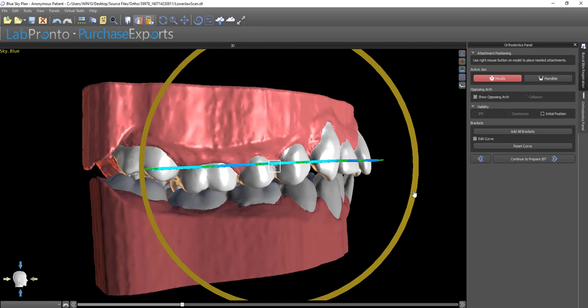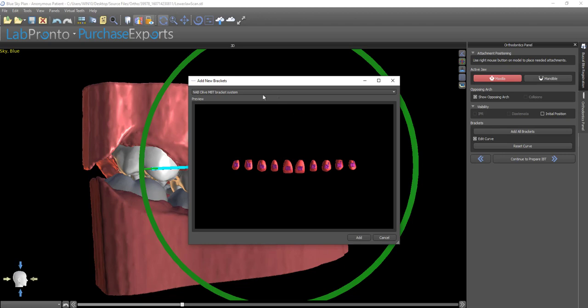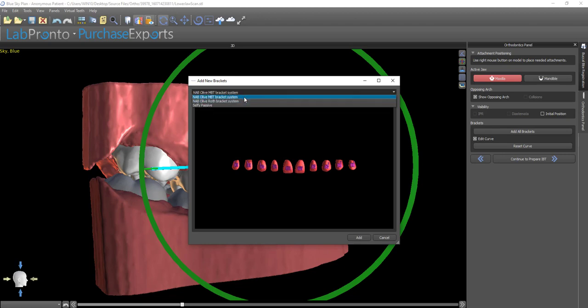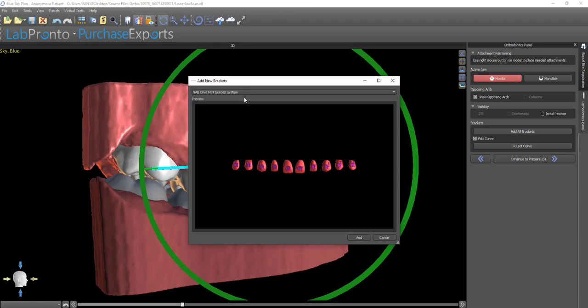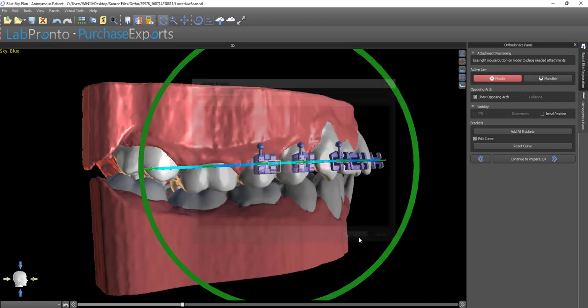Once we have the curve in the general positioning, we click Add All Brackets and select the set of brackets we're interested in placing. The brackets that appear on the list are distributed by BlueSkyBio and can be ordered from BlueSkyBio.com. Then click Add.